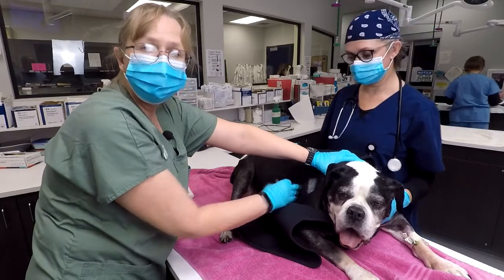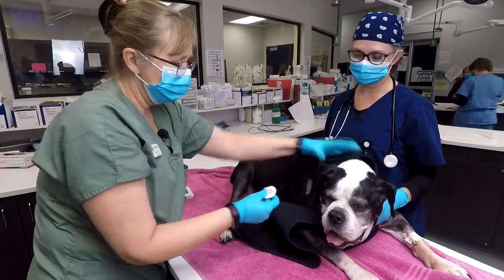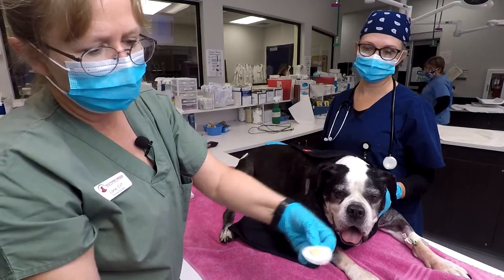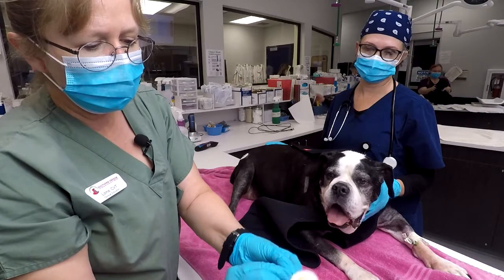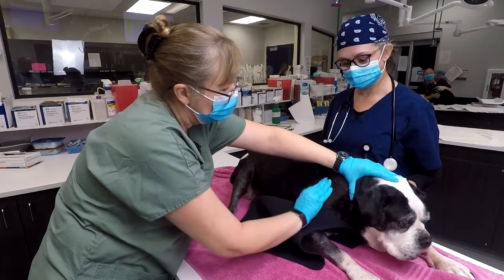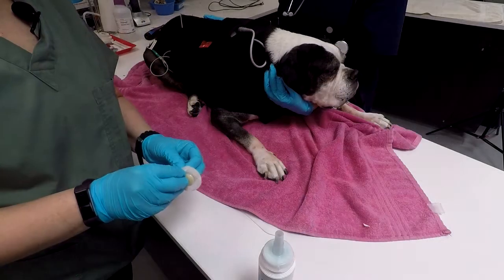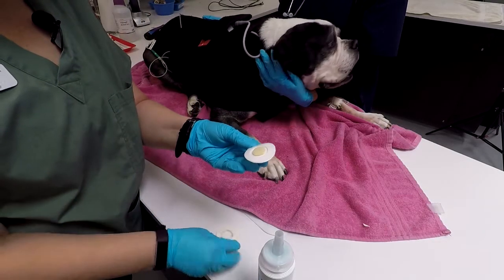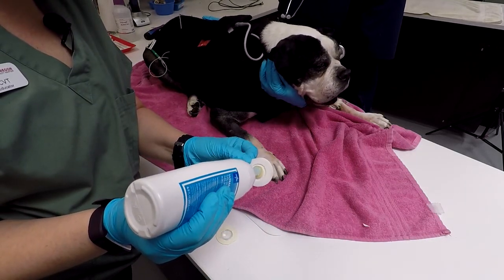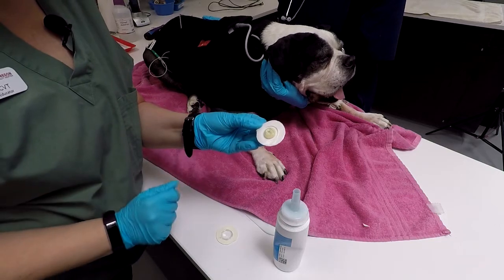Clean until you're not getting any residue back on the gauze pads, to make sure you've removed all the oil from the skin. To place the pads, peel the backing off to expose the wet electrode and place it on the skin, applying pressure for about 15 to 20 seconds to ensure good adhesion. One tip: once you open the pad, apply just a tiny drop of gel to the center — this will help with conductivity. Be careful not to get it on the adhesive strip around the outside; if you do, use a new pad.